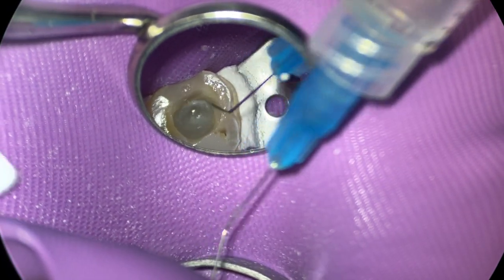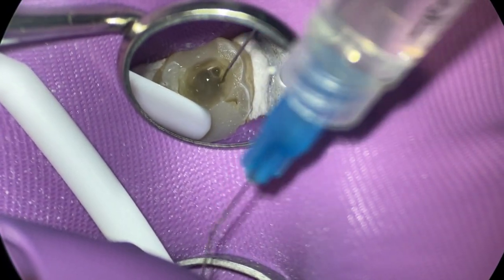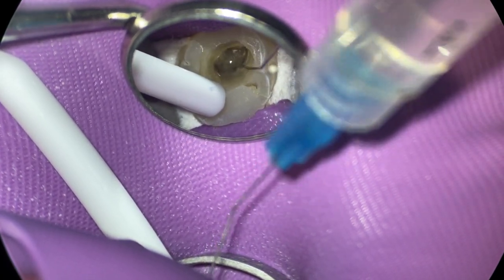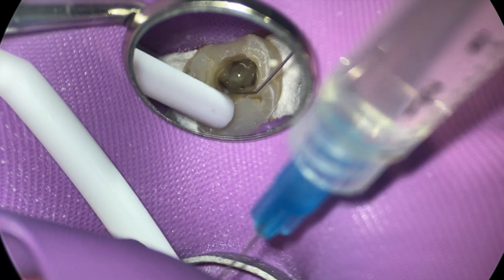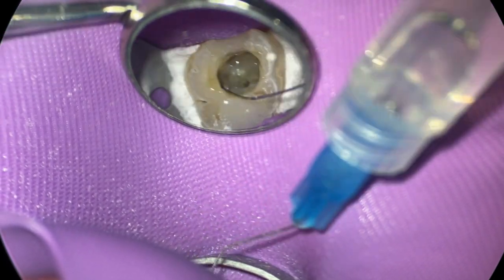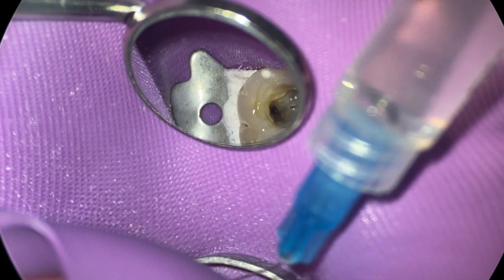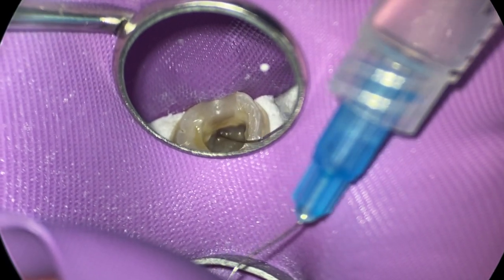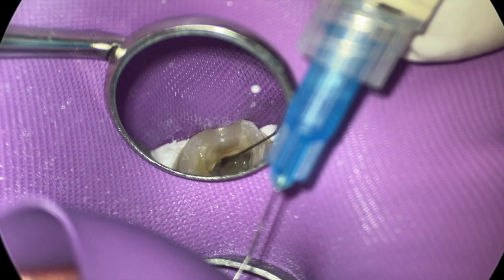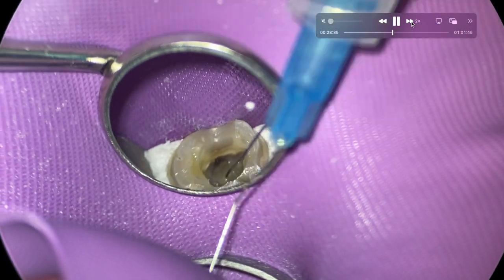My experience has been to do the best job possible is to open up that apical portion to a size where you get debris on your apical flutes, and then you can be much more confident when you seal the case up. A lot of what we do, machining, what I was taught and trained, and I still believe today, machining is the path to getting irrigant down there, whether it's full strength or half strength, just getting irrigant down there to disinfect and break down vital tissue. So you got to use a lot of irrigant, lots.